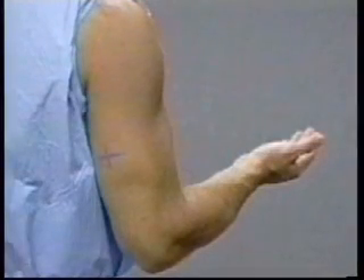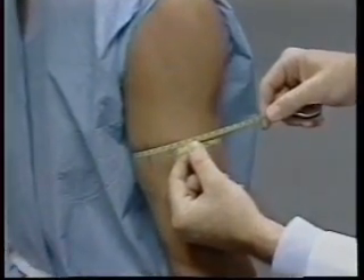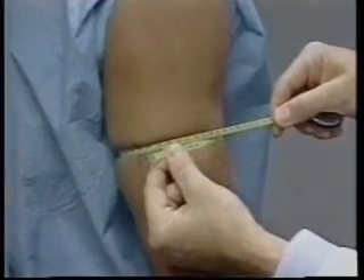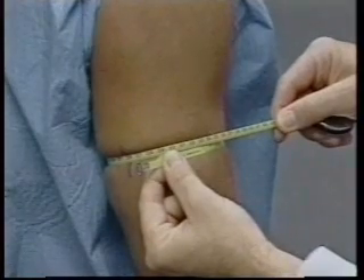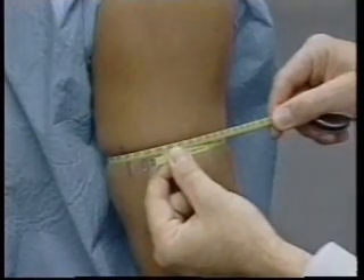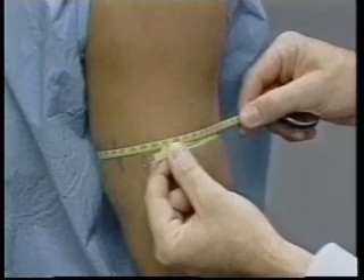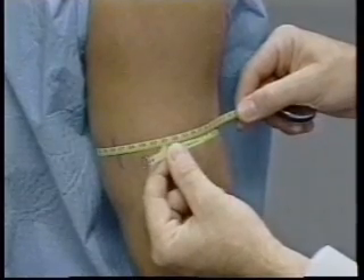This mark was made previously when the upper arm length was recorded. The measuring tape is held gently on the skin surface. The two ends of the overlapping tape are pulled together using care not to compress the skin and the underlying subcutaneous tissue. The arm circumference is recorded from the measuring tape on the lateral aspect of the arm to the nearest millimeter.